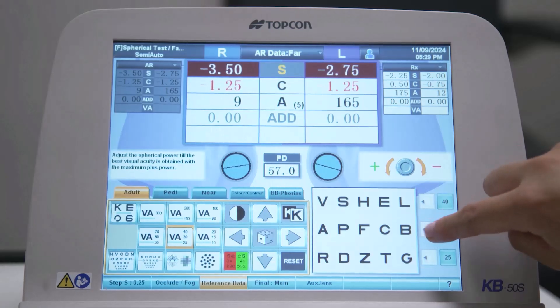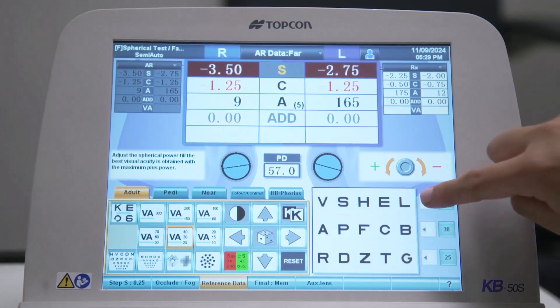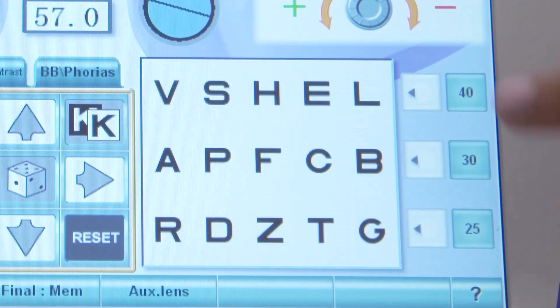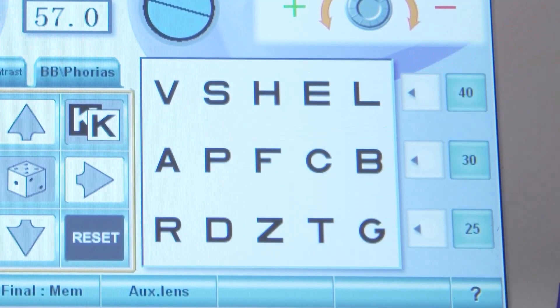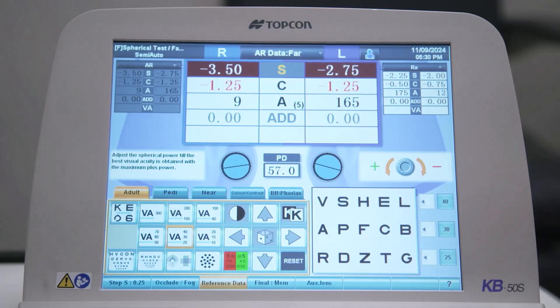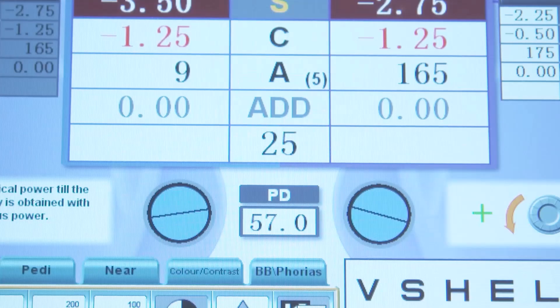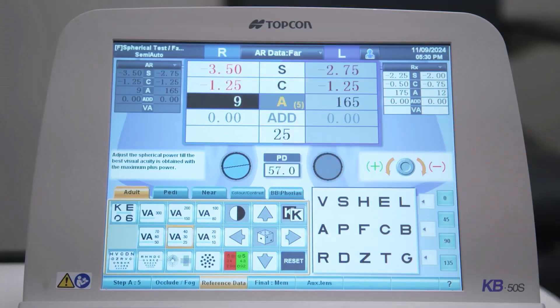For example, when displaying a visual acuity chart, each of these arrows isolates a single row of letters for the patient. Selecting the same arrow again will unselect the row to reveal the entire chart. The chart display area also includes the visual acuity value next to each row. Once the lowest line that a patient can read has been identified, select the value next to the line to record the VA.